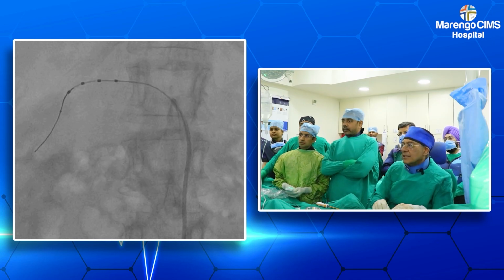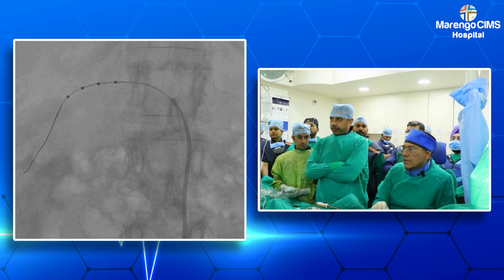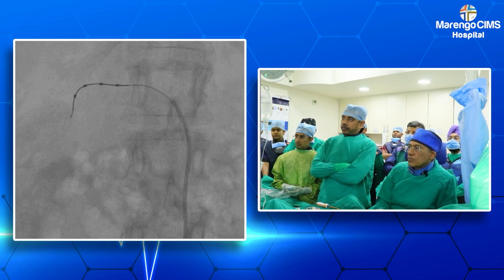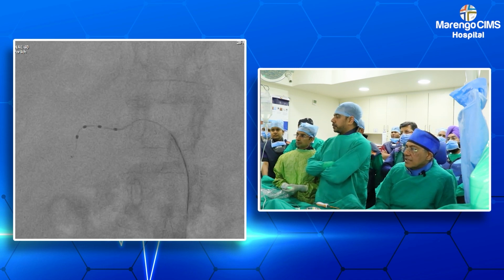Before the ablation, the wire has to be pulled back into the guide. So we have done that. Make sure you don't pull the wire out of the proximal port of the wire. Otherwise, you will have to reintroduce the whole system once more again. So Dr. Vipul now has turned off channel 3 and 4 and he will start the ablation.